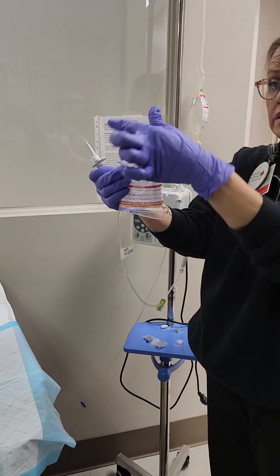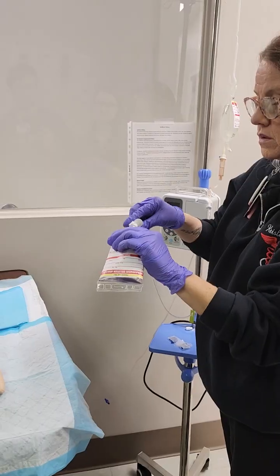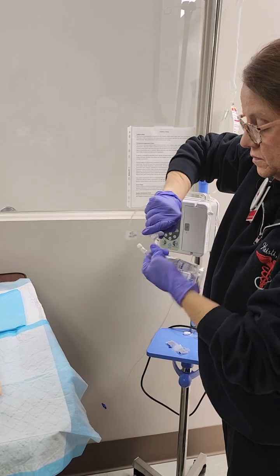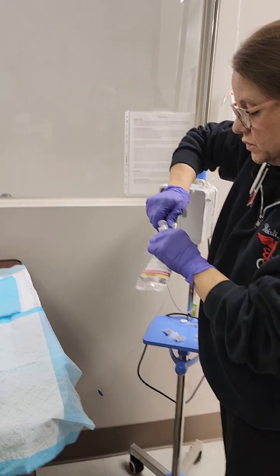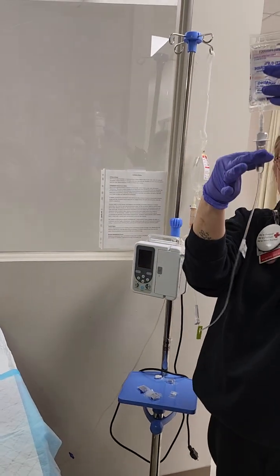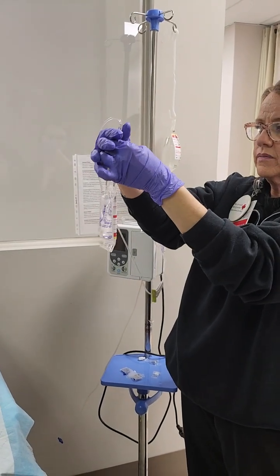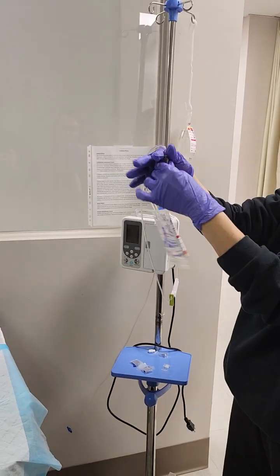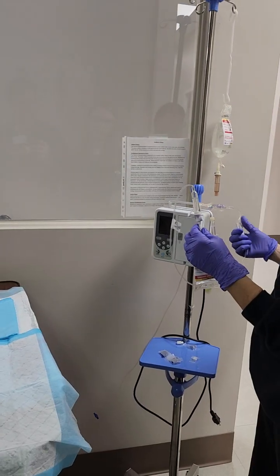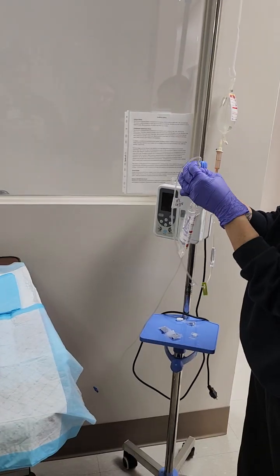Don't contaminate your spike. This is my spike port, take off my blue cap. Push and twist. This is just me adding this to an existing line. You want to be able to see your drip chamber and see how this is full. Flip it upside down and just push it into your bag. There it goes. And that way I can see my drip chamber.